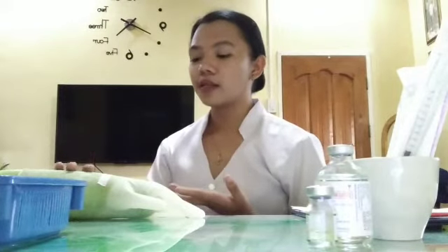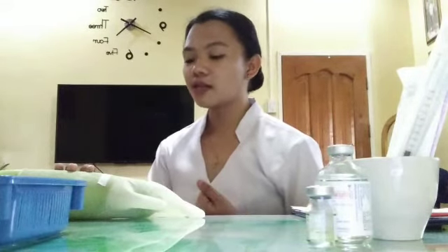So good day, ma'am. My name is Ayessa Camille Dumile. So today I will be your student nurse, and I will be performing the intradermal injection. So your name is Lorna Lopez.